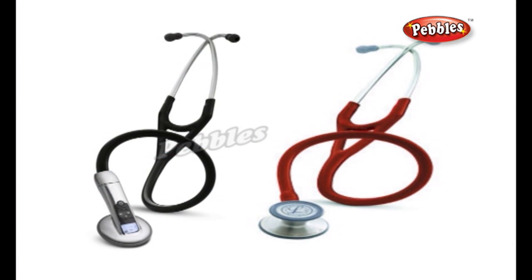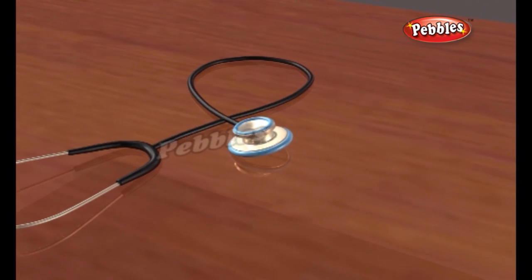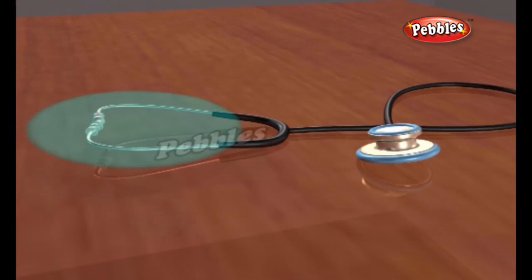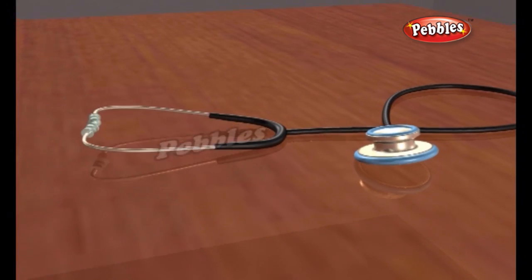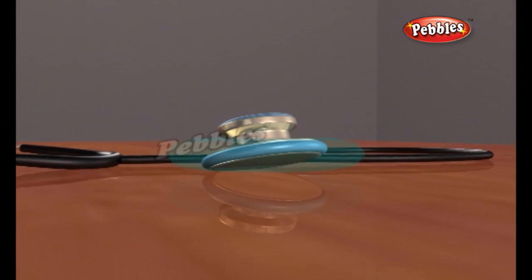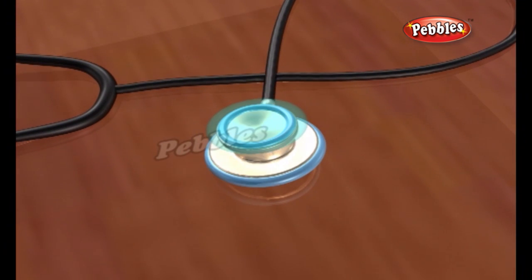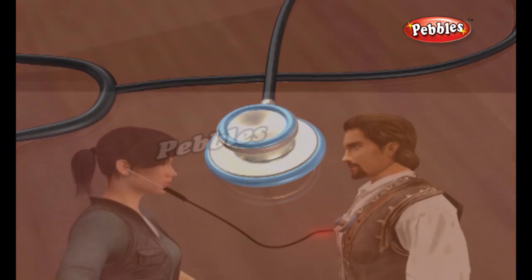There are two types of commonly used stethoscopes: electronic and acoustic. Acoustic stethoscopes consist of a chest piece, two hollow air-filled tubes, and the ear pieces. There are normally two sides to the chest piece: the diaphragm, a plastic disc, and the bell, a hollow cup.